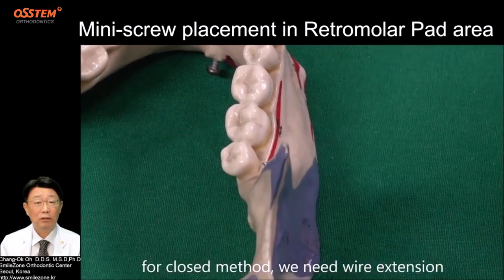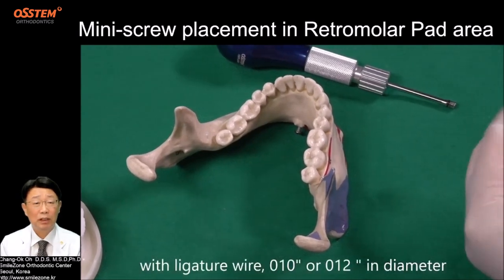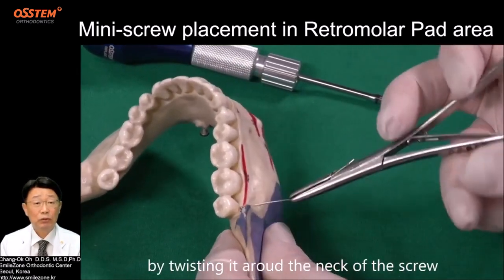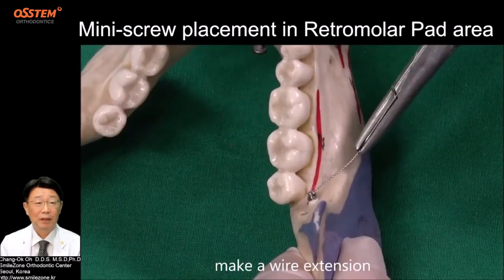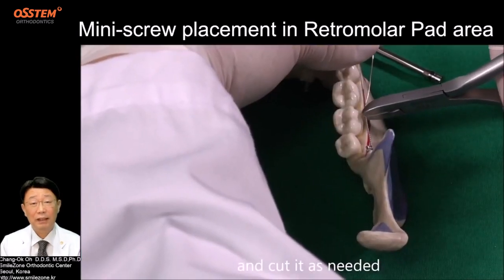For closed method, we need wire extension. Before the head sinks into the tissue, with a ligature wire, of 10 or 12 in diameter, by twisting it around the neck of the screw, make a wire extension and cut it as needed.